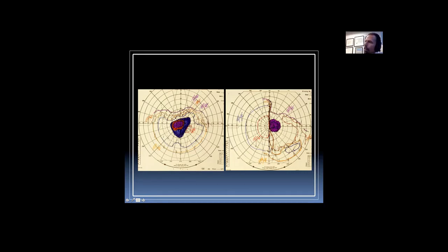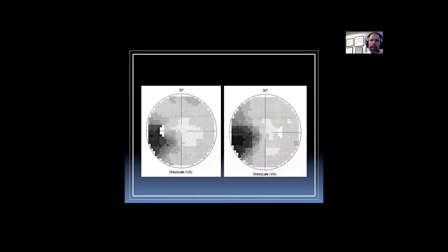And so they have exactly the same thing our last patient had. They have a big central scotoma because the left optic nerve is being compressed, and they've lost most, but not all, of the temporal field on the other side. So this is an anterior chiasmal syndrome, but this is a left anterior chiasmal syndrome. So you've got the left optic nerve plus most, but not all, of the fibers crossing from the other eye in the anterior chiasm. So left anterior chiasmal syndrome.